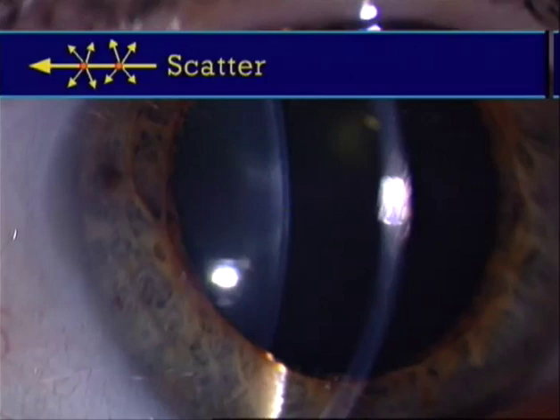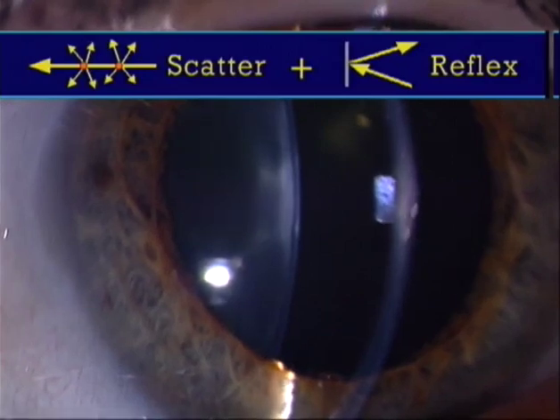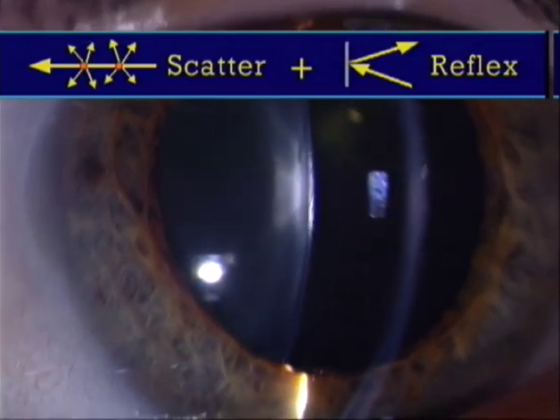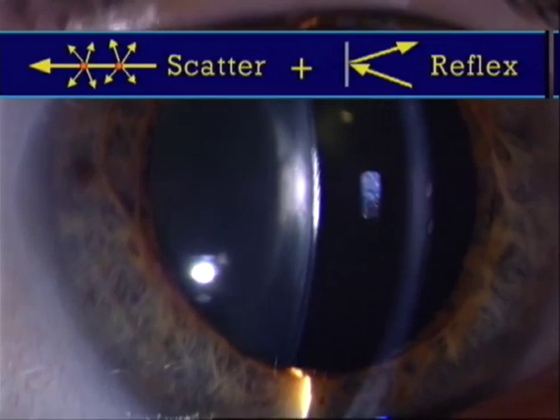How can the examination of optical sections be optimized? As the example of this lens shows, a maximum of details can be discerned if the phenomena of light scattering and specular reflection are combined. For this purpose, the optical section is brought to a position where specular reflection is reached. Then the optical section reveals previously invisible phenomena in the lens cortex.